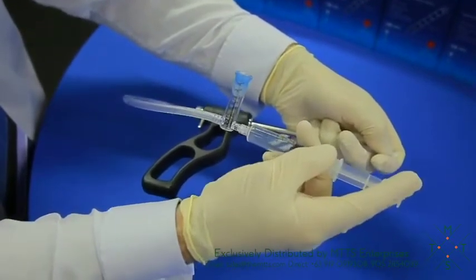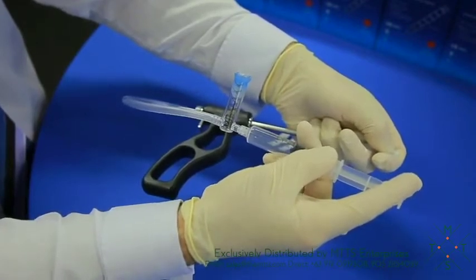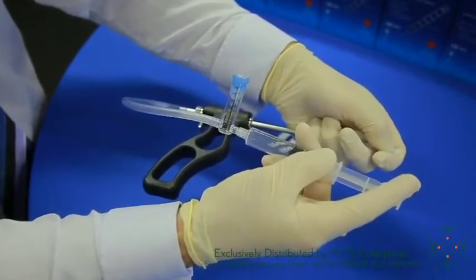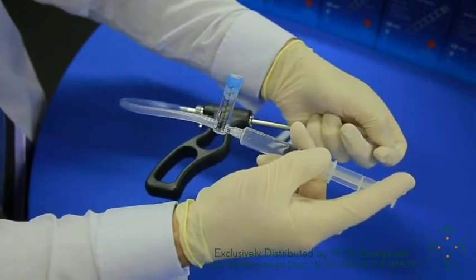When you're satisfied that you haven't got too much pressure on the mucosa and also that you've maintained the suction, then it's time to take the biopsy.